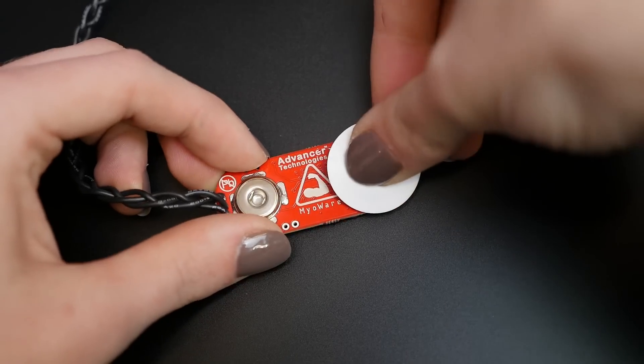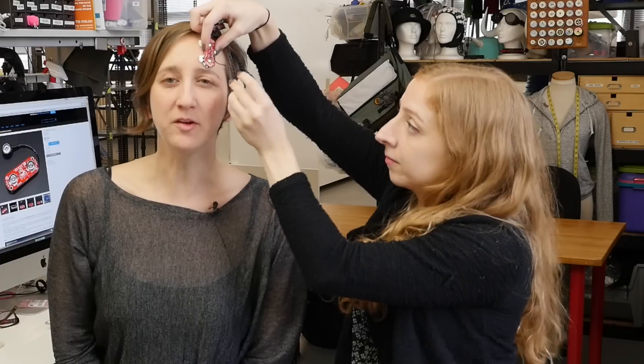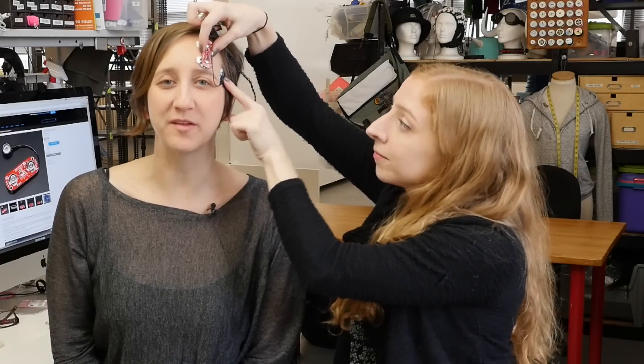Snap the electrodes to the three connectors on the sensor. The one closest to the wires should go at the middle of the muscle that you're sensing. The other one should go towards the end of the muscle. The third electrode at the end of the black wire should go somewhere else, away from the muscle that you're sensing.